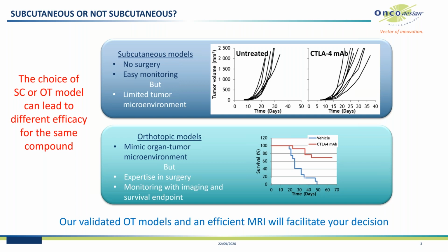But in practice, orthotopic models are less used than subcutaneous models because they need more expertise in surgery, the monitoring of these models is more complicated, and it's more complicated to handle. So our goal today is to show you that with an efficient MRI workflow, it becomes possible to follow your orthotopic models.